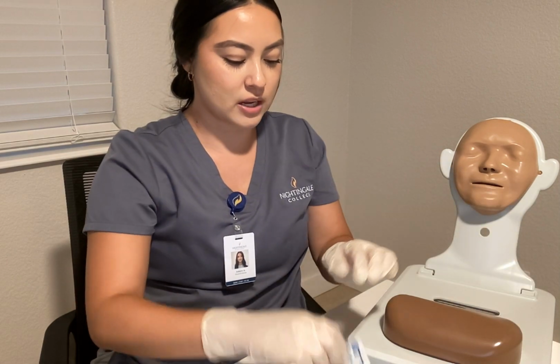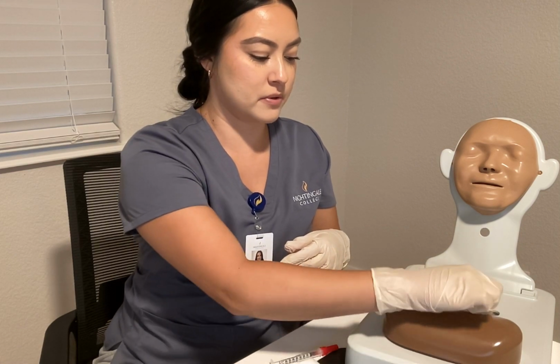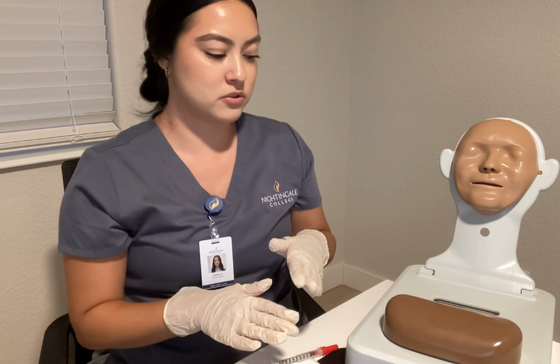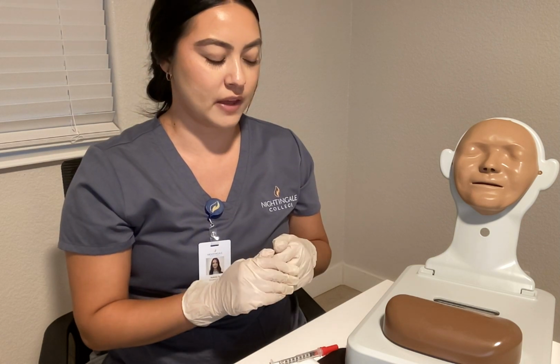Once I visualize it, I'm going to clean the area, and I'm going to start in the middle and go counterclockwise out. And with this, I'm not going to wave my hands, I'm not going to blow on it. We're just going to let that dry.